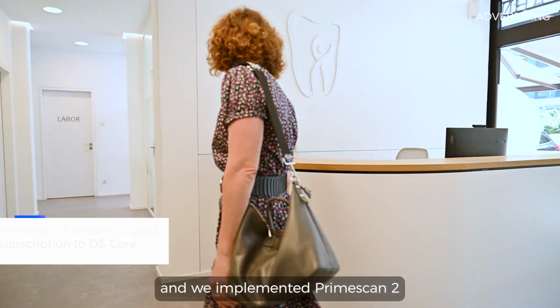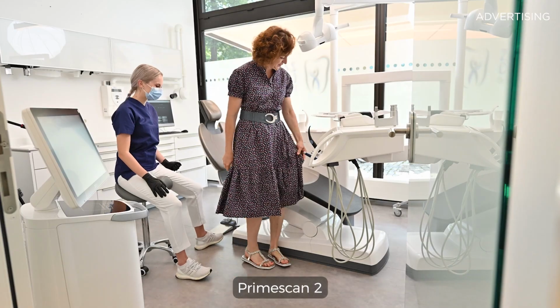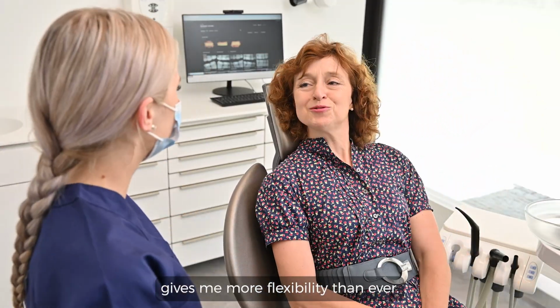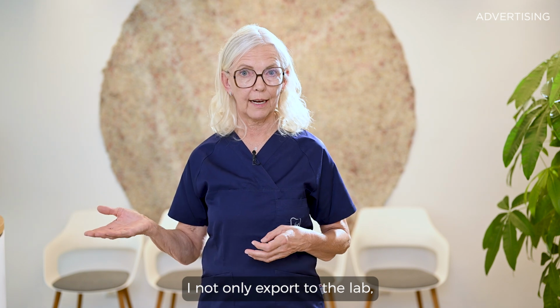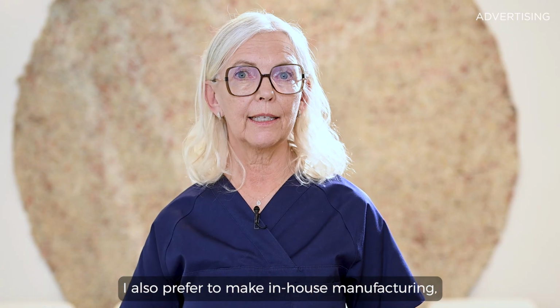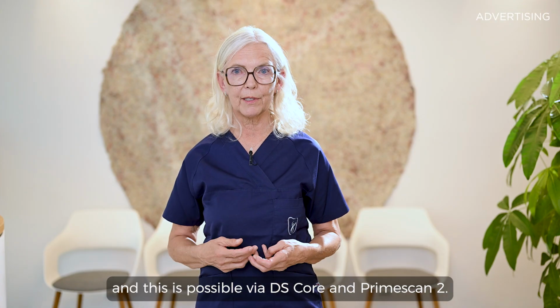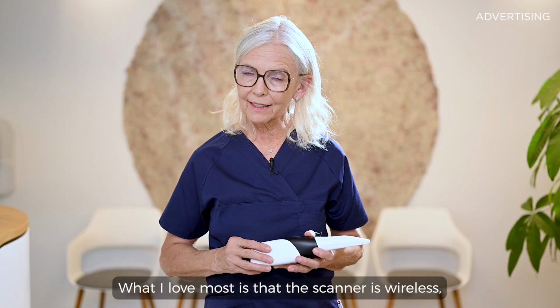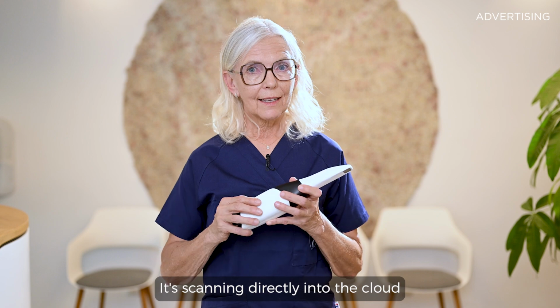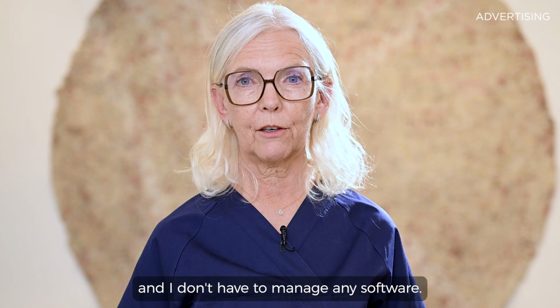I am Dr. Gertrud Fabel and we implemented Primescan 2 into our digital workflows most recently. Primescan 2 gives me more flexibility than ever. As a restorative dentist, I not only export to the lab, I also prefer to make in-house manufacturing, and this is possible via DS Core and Primescan 2. What I love most is that the scanner is wireless, but it's way more. It's scanning directly into the cloud, and I don't have to manage any software.